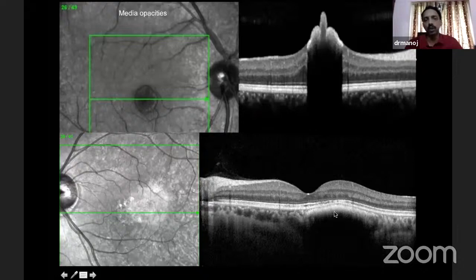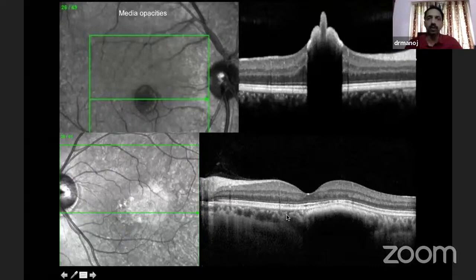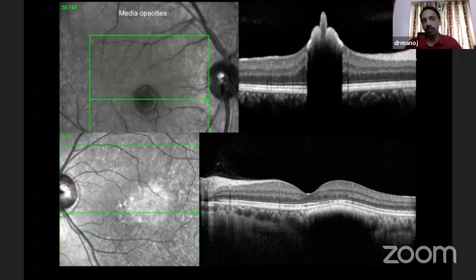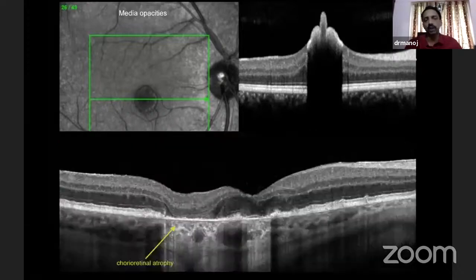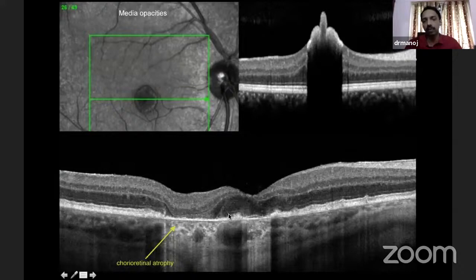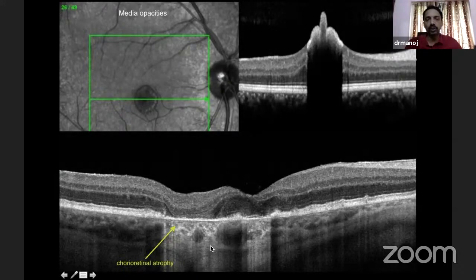In this lesion here, you see there is a choroidal lesion which is not allowing the light to pass through. When you have opacities, it means something or it rules out certain lesions. In this example, the retinal layers are absent, and because of that, light passes in easily and therefore the choroid gets highlighted. We have to keep these principles in mind before you start looking at OCT images.